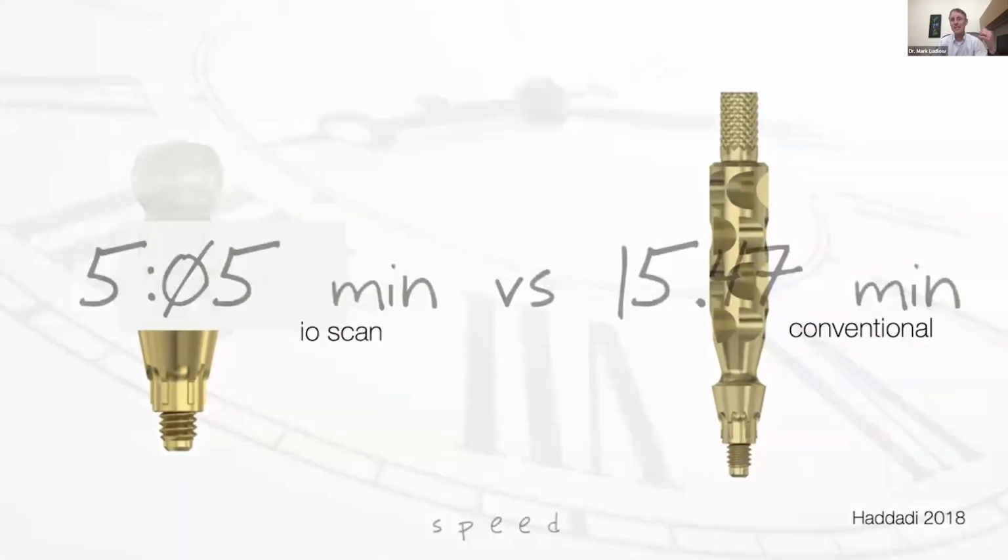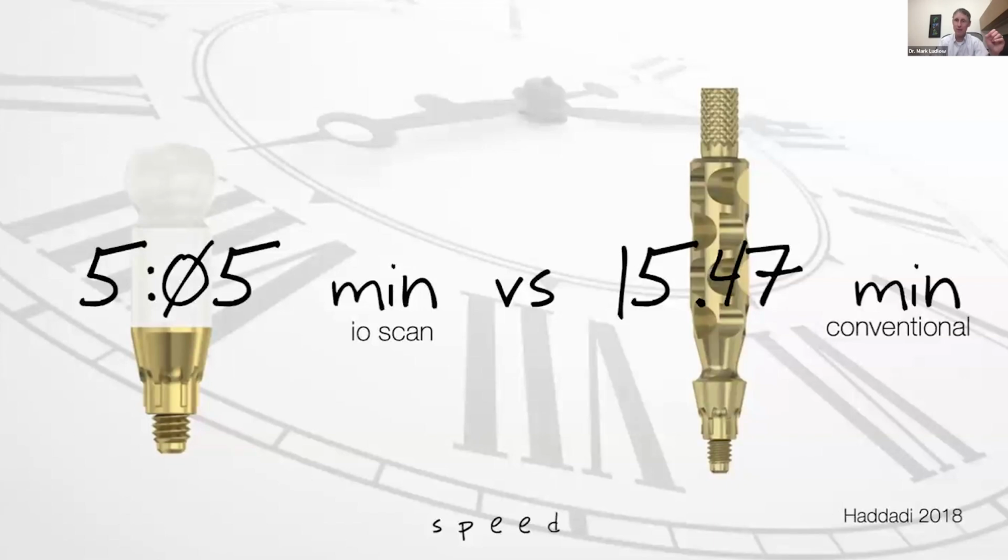Now, when you look at it from a time perspective, this is what was absolutely very interesting. About 5 minutes total for all the scans and everything you'd need for the intraoral scanner, versus about 15 minutes for conventional. Now, that's for a simple implant.